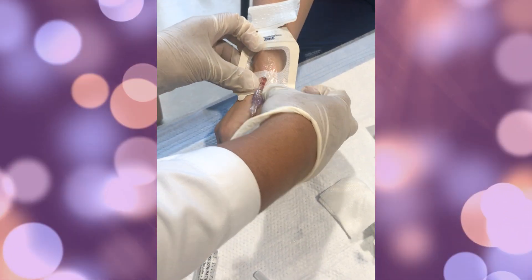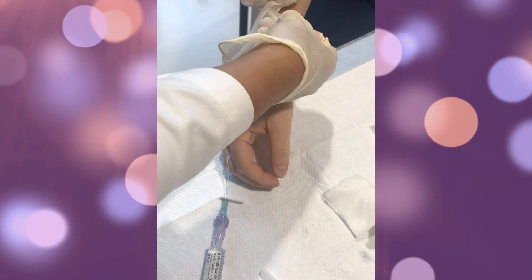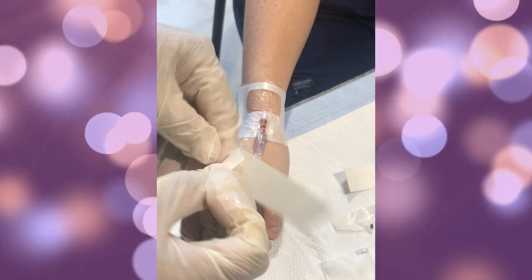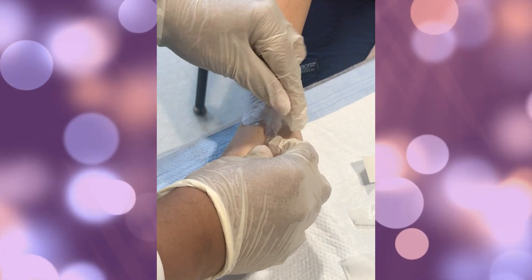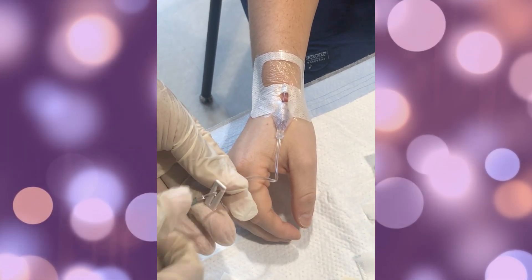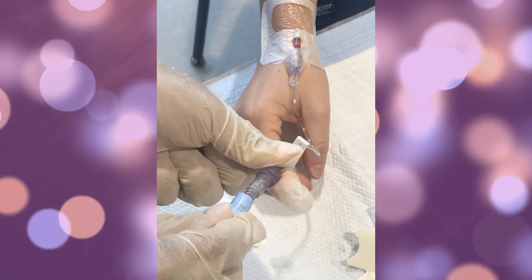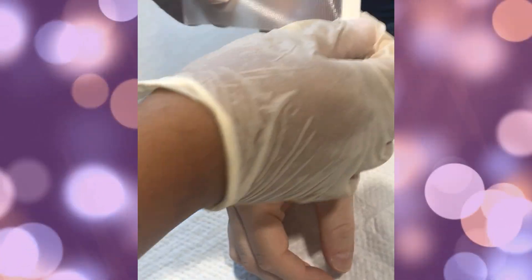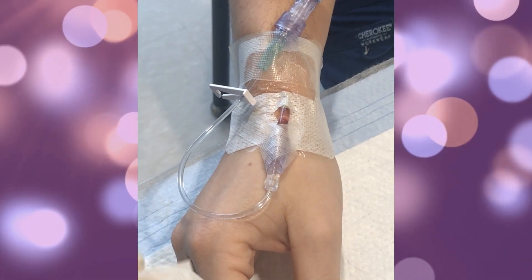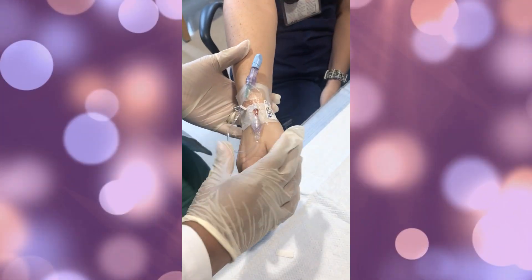After the IV site has been flushed, place a tegaderm or dressing over the site to secure it, then use a couple of pieces of tape. Once the tegaderm is placed, put a piece of tape and crisscross it over the IV catheter to one side and then the other. Clamp the tubing, remove the flush, and place a cap on the end of the tubing to prevent any microbes or bacteria from entering. Then add an additional piece of tape to the IV catheter to secure it to the extremity.